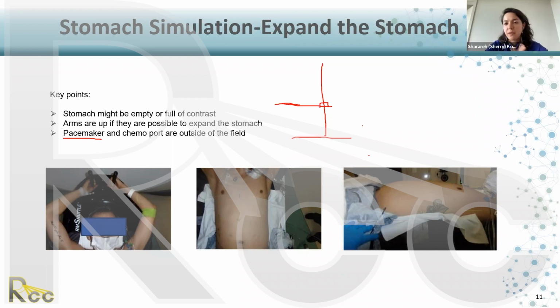Yeah. Great point. Thank you so much. And what about the chemo port and the pacemaker in breast? That doesn't matter. Chemo port doesn't matter. It's just some part, so you can tolerate the radiation. Pacemaker electronic devices, again, 5 gray is the take-home message. Try to make sure it's 2 gray. Depends on the brand, actually.